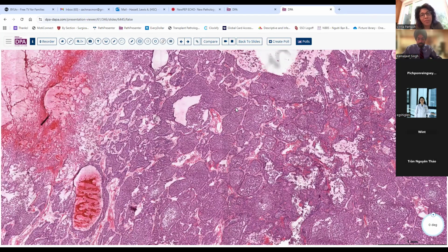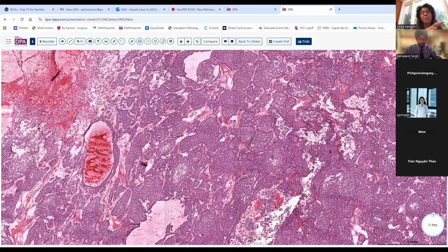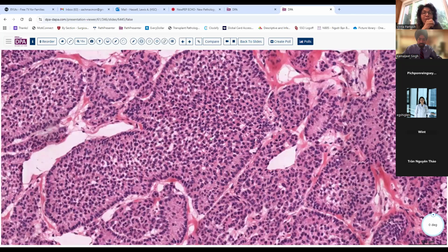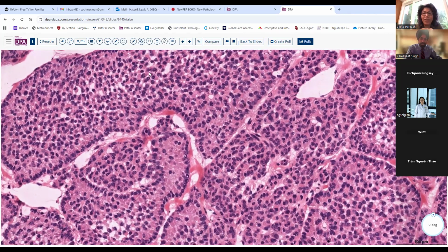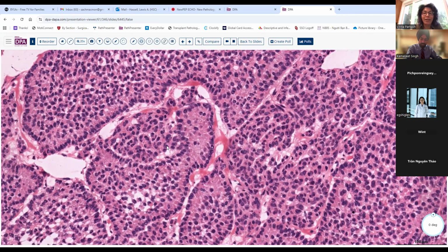So I guess first, as to how I would describe this tumor, to me, there's a nested trabecular sort of appearance, and all of the nests seem to have sort of peripheral palisading, and then in the closer up, you have this. Somebody used the word pseudo rosette. There seems to be this organization, at least in some areas, where the cells are at the periphery. You're just coming up on something that looks like either a small gland. On my screen, I'm seeing it at about 5 o'clock.